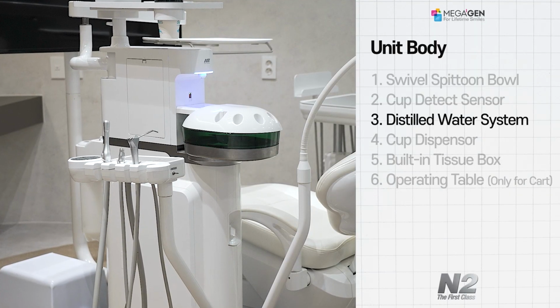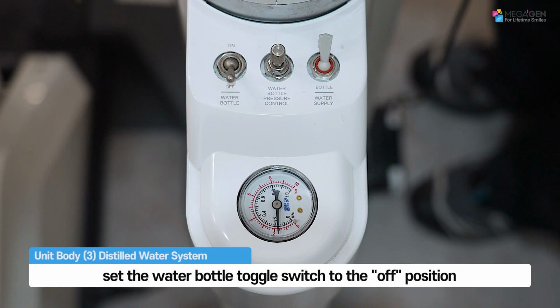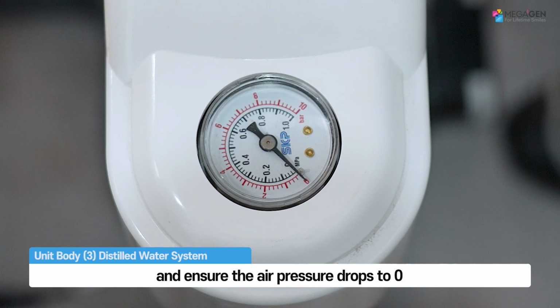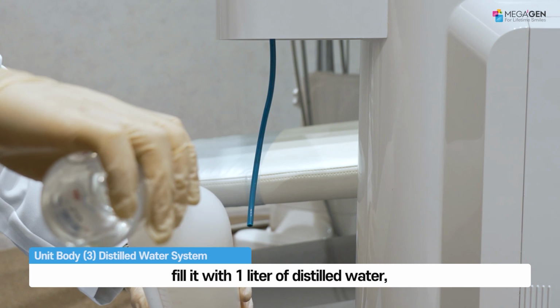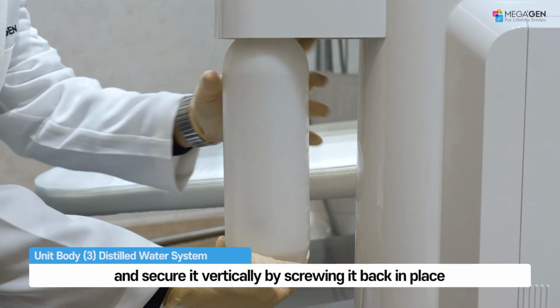How to use the distilled water bottle. Before removing the distilled water bottle, set the water bottle toggle switch to the off position and ensure the air pressure drops to 0. Then, turn the bottle counterclockwise to remove it. Fill it with 1 liter of distilled water and secure it vertically by screwing it back in place.